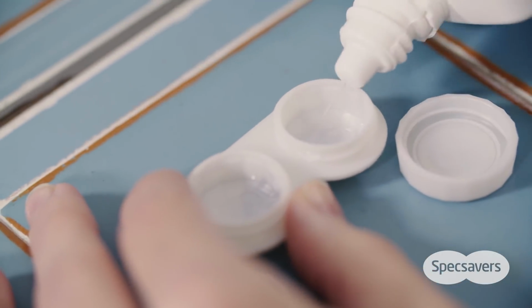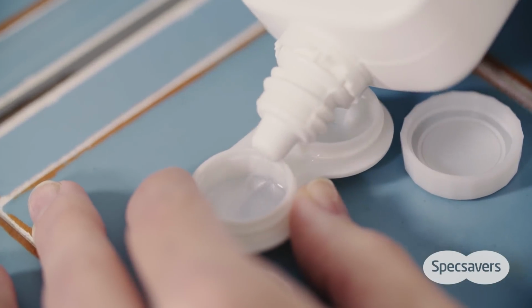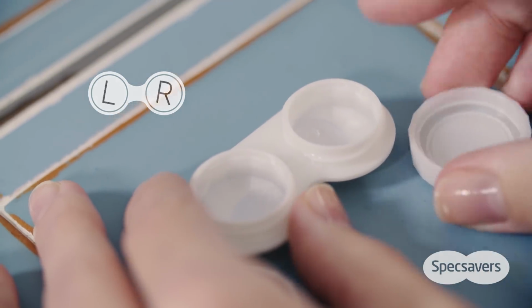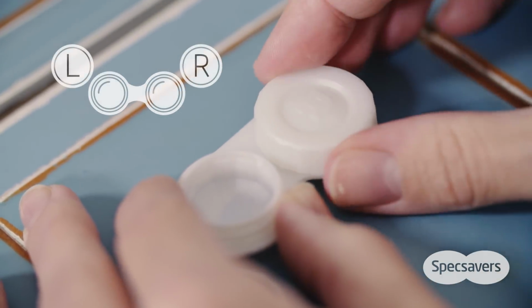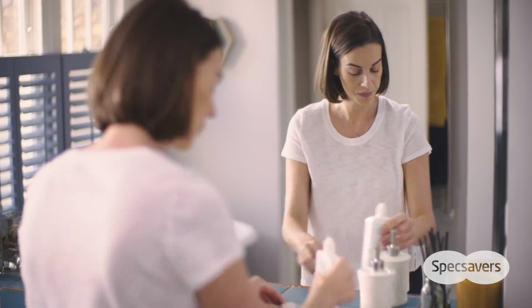Place your lens in your case and cover with fresh solution. Never top up old solution. Make sure you put the correct lens in the correct side, R for your right eye and L for your left. You should do this every day. If you don't leave them in the solution overnight, they won't be fully disinfected.